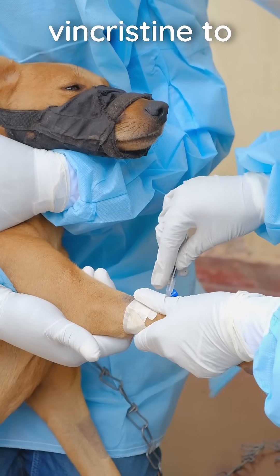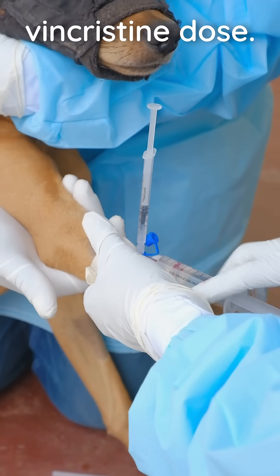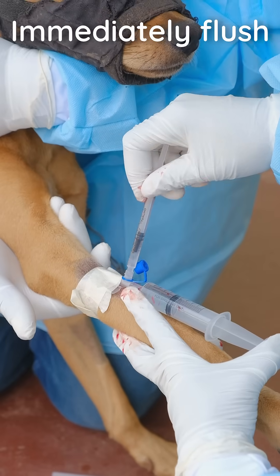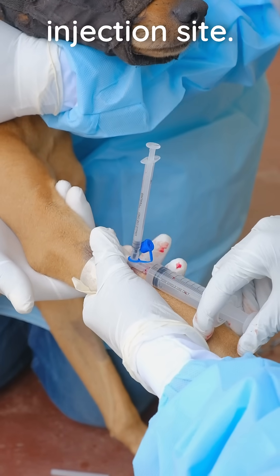Attach the flush syringe to the lower port and vincristine to the upper port. Inject 5ml of flush solution followed by the vincristine dose. If there's any sign of extravasation during the flush, stop immediately. Extravasation causes severe tissue damage and must be avoided at all costs. Immediately flush with the remaining 5ml to ensure no vincristine remains at the injection site.